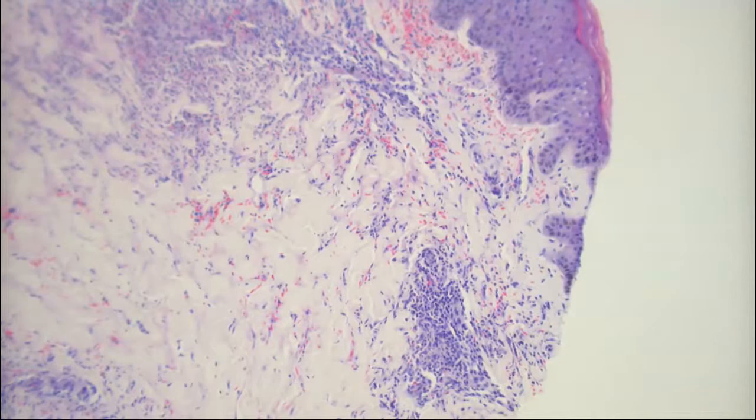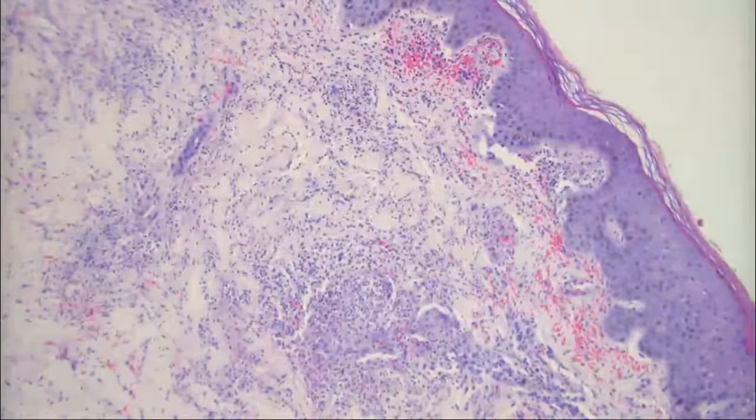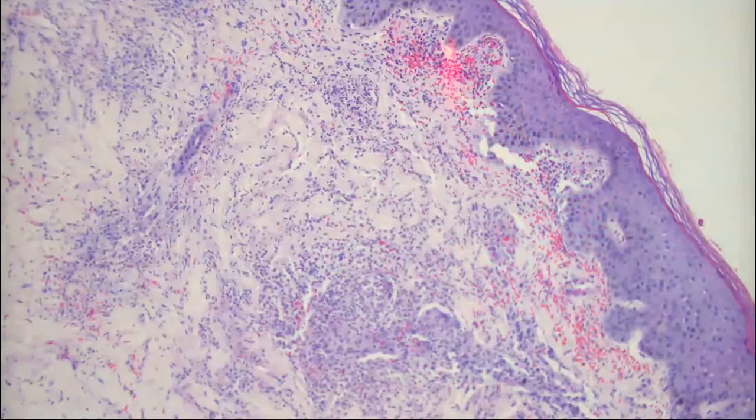But bullous lupus, linear IgA bullous dermatitis, there's a number of things. When you see these nice collections like this, really pretty good for DH. So you'd obviously want to do immunofluorescence here to confirm that, right? Okay. This next one is very good because, again, it's a pattern diagnosis.